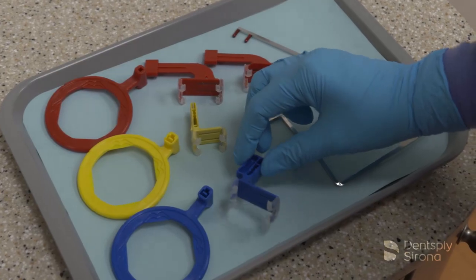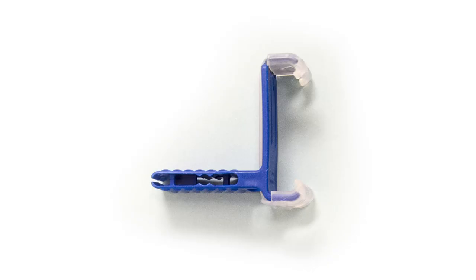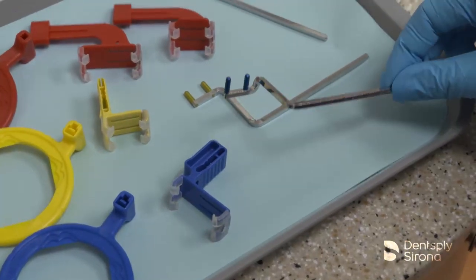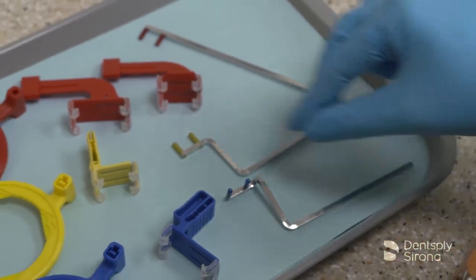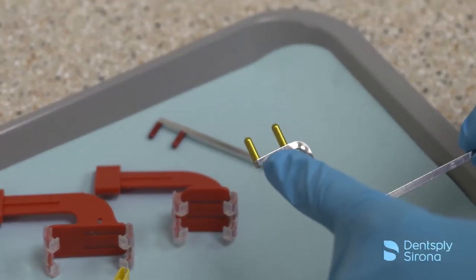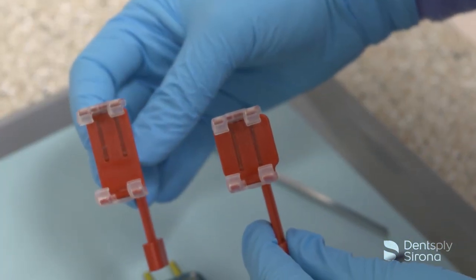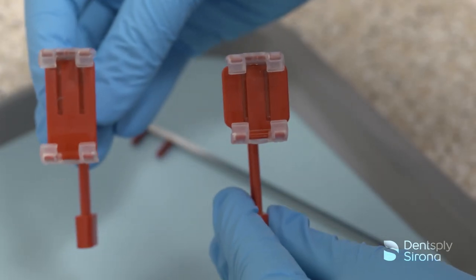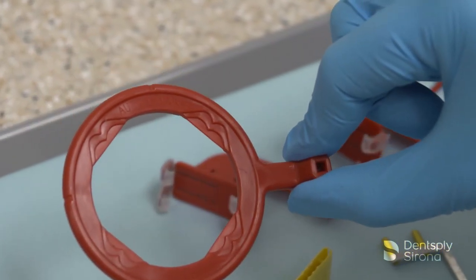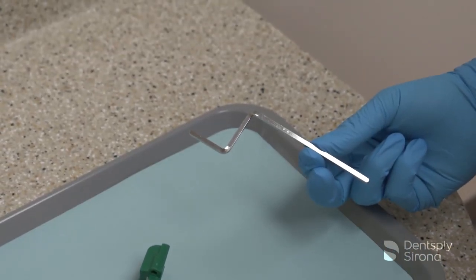The blue bite block is used for anterior radiographs and is available in two options: a thicker bite block and a thin bite block, making it easier to place with a size 2 sensor. It corresponds with the metal arm and ring with the blue pegs and blue ring. The yellow bite block is for posterior periapical radiographs with the yellow arm and ring. The red bite block is for bitewing radiographs, available in horizontal or vertical orientation with the red arm and ring. There is also a green bite block for endodontic radiographs with a green arm and ring.